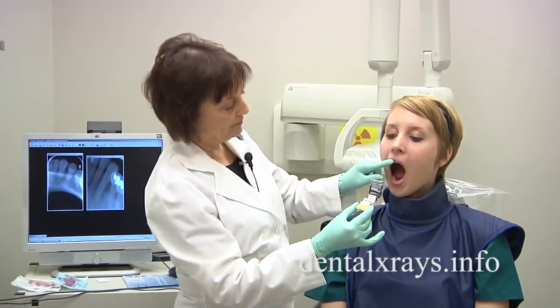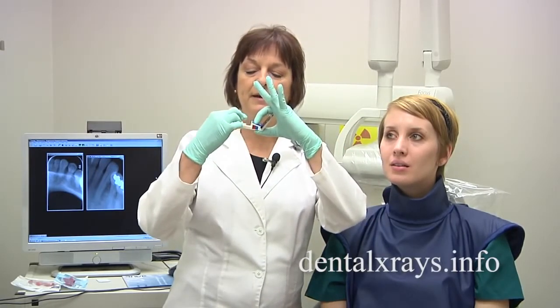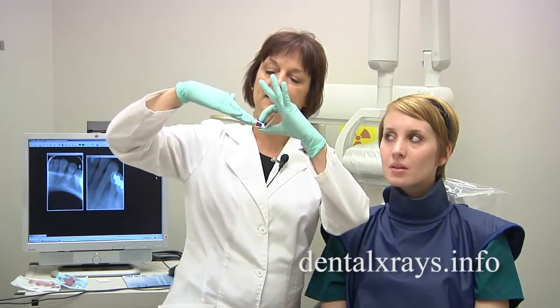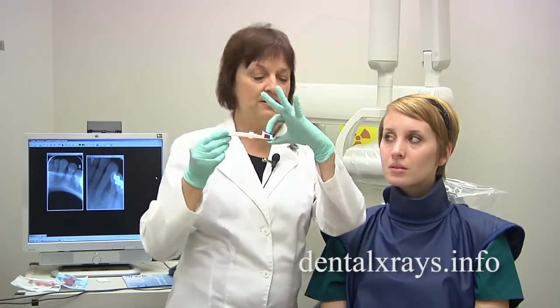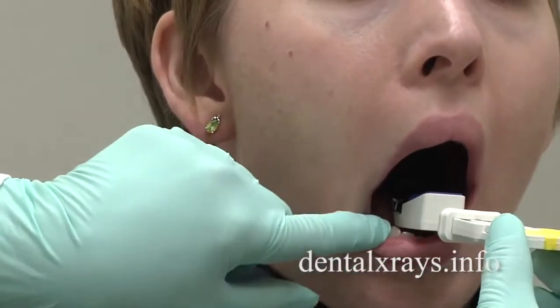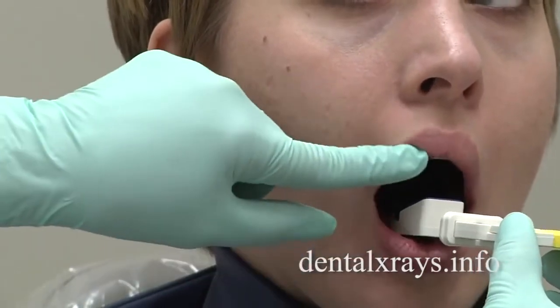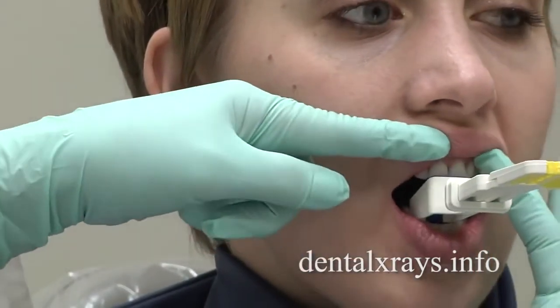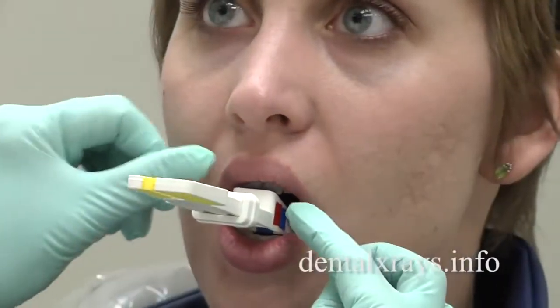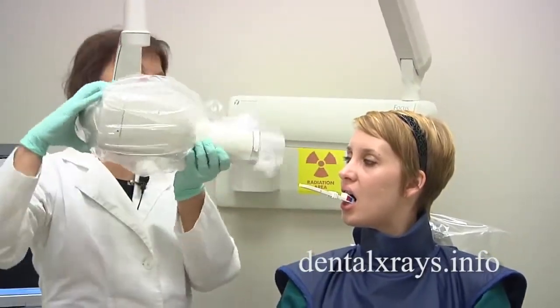This instrument really helps guide your cone so that you are getting the correct angle. We're going to do the upper ones to start with and have her gently bite down right here. If you notice the slant of the bottom edge she's biting on — the little bite tab — you're going to actually vertically set your tube so it's in the same line as this piece is directed. I'm going to just place this in; the bottom edge needs to go in enough so that it fits between her lower arch — you don't want it out here, you want to seat it deep enough so that it fits.